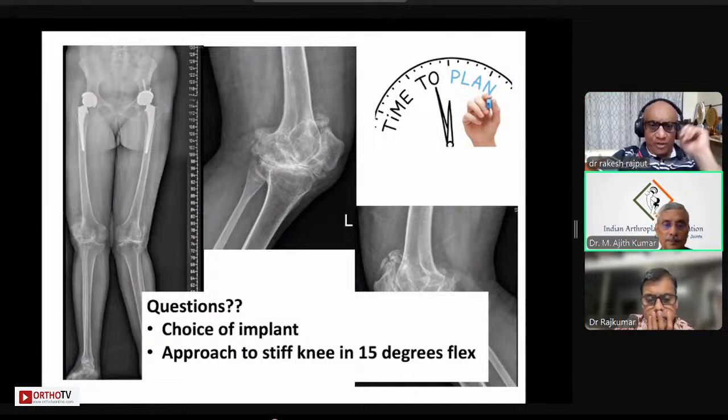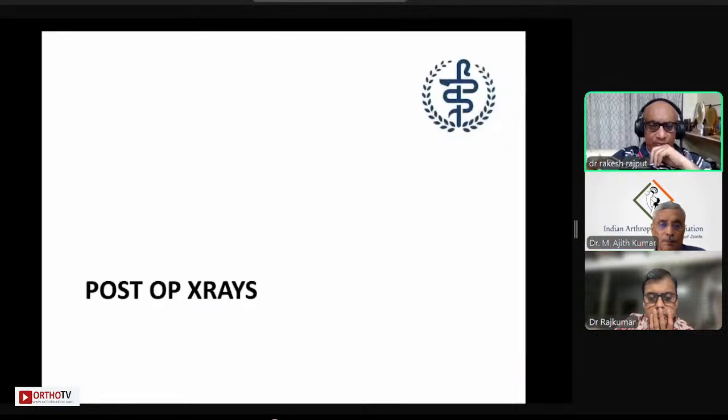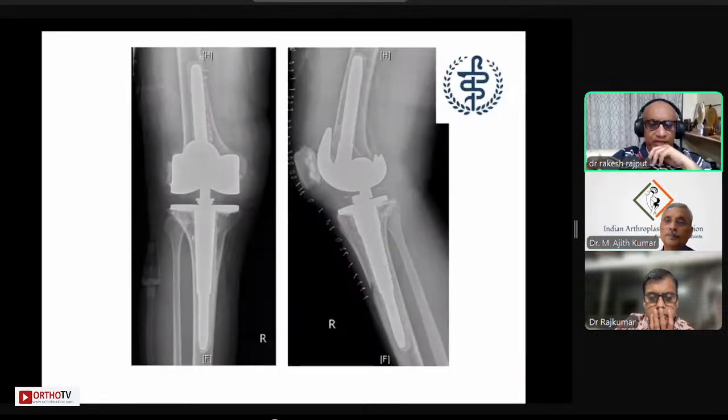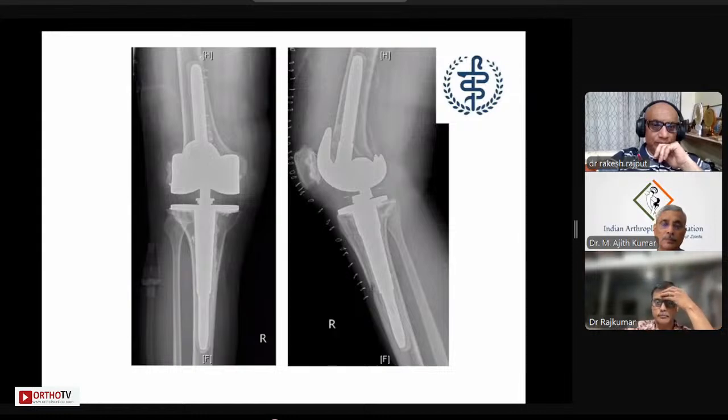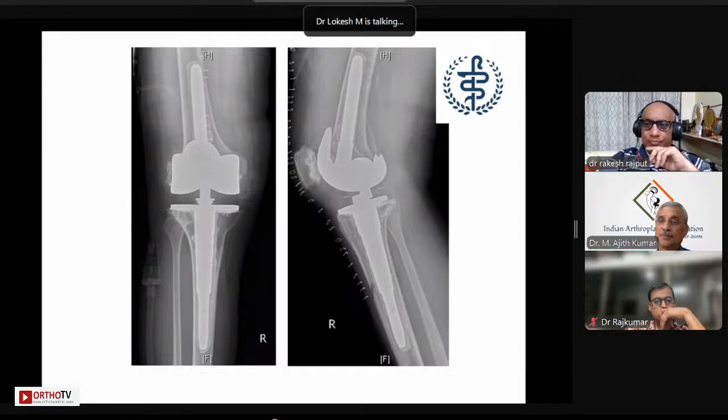Okay. So Lokesh, there is a question from one of the audience: what is a femoral peel? So you want to explain that? Sir, we released both MCL and LCL during the process of our arthrolysis, sir. We have to skeletonize the distal femur fully. So that means you have to be prepared with the hinge. Yes, sir. That's mandatory in your planning.